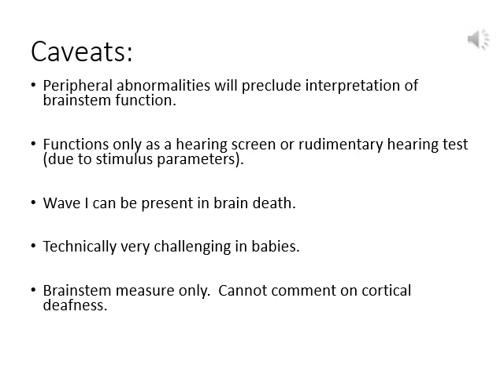First, peripheral abnormalities, including hearing loss or any occlusion of the outer or inner ear, will affect the BAEP and preclude interpretation. The BAEP, if used for assessing hearing, is only a hearing screen or rudimentary hearing test, as the BAEP protocol that we use in neurology only tests at limited decibel levels and only with a broadband click. We do not do the full hearing test, which is done at different decibel levels and different frequencies that would be done by audiology.